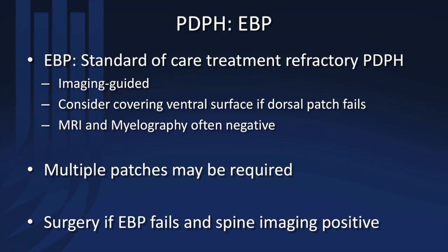So I guess what are the take-home messages? Yes, epidural blood patching is the standard of care for refractory post-dural puncture headaches. So for those of you though that aren't on my side of it, the thing that I think is really challenging is when you have these chronic cases. Oftentimes we don't know what the level is, whether or not it really was a leak, and people, I can understand, are reluctant to say whether or not it was a wet tap, but that's really helpful information if that's in the chart, right? And we know where to go. And a lot of times the imaging is negative, and so because of that, it's really dependent on the story, and that makes it challenging.